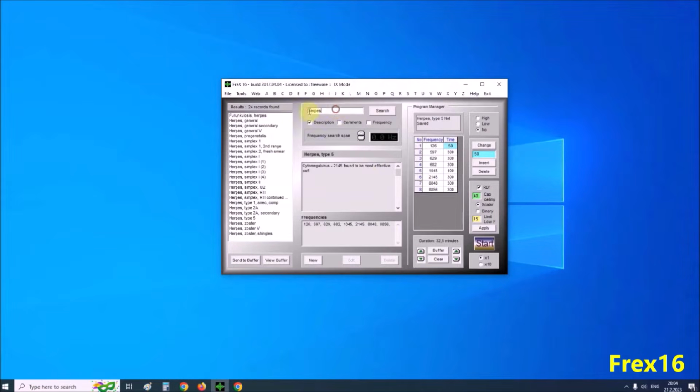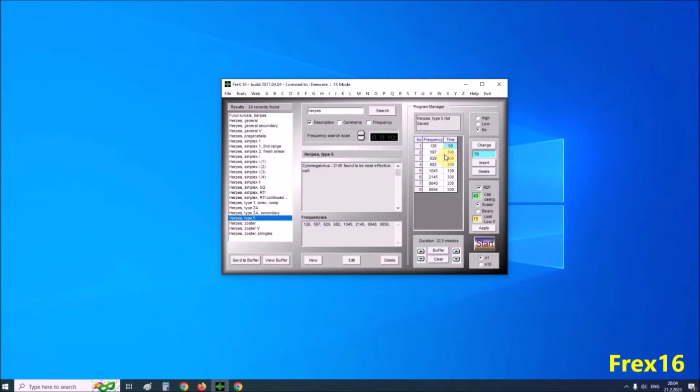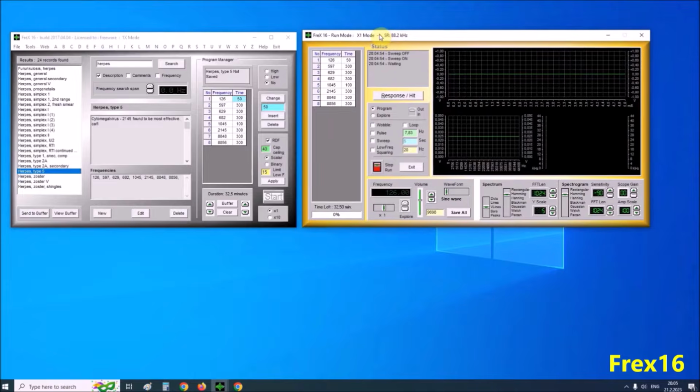If you like to find the new program, here's the new entered program with the name test. Now we press the start button and the following screen appears. On the left is the entire therapeutic program as well as its duration. In our case 32.5 minutes.